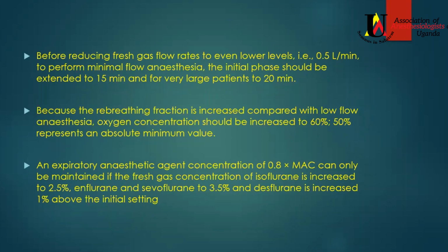You want your oxygen and whatever carrier agent to reach that plateau phase before you initiate your low flows. And if you are dealing with really large patients, you can even extend this initial first stage of the high flows to 20 minutes, because it will take time to get blood gas saturation and also fat and agent saturation.